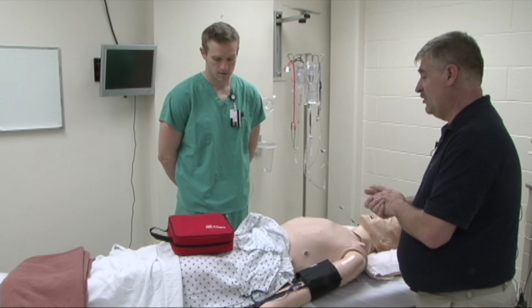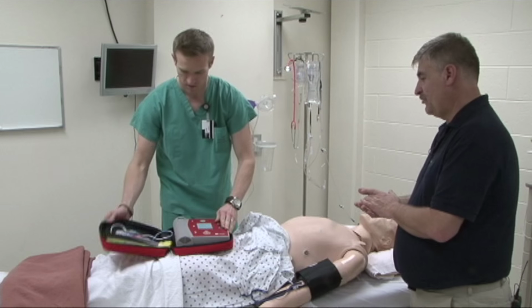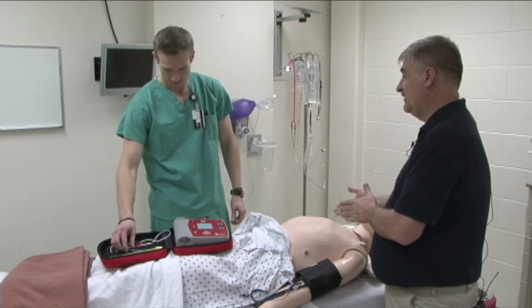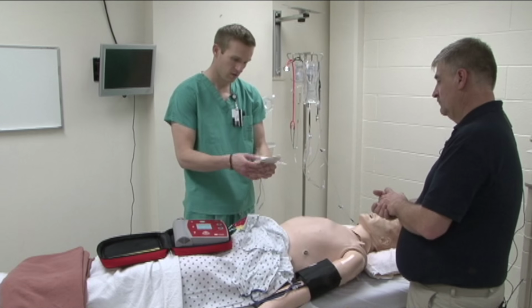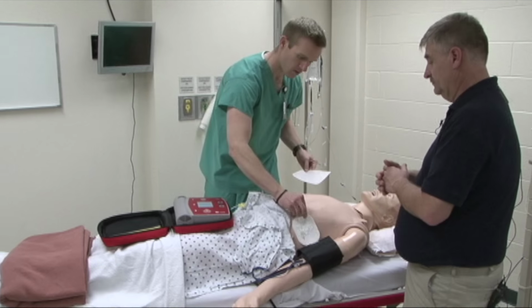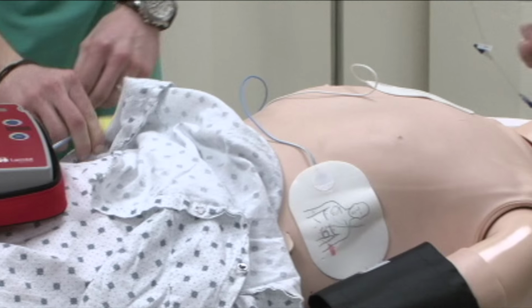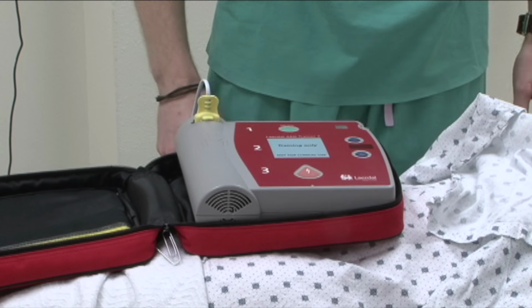Christian, what you're going to do is go ahead and open up the AED. Great. And now you're going to turn on the AED, which is on the button there. The second step is you're going to place the pads on the victim itself. There's a picture on the pad that tells you exactly where to place them. Like that? There you go. And now you're going to plug in the AED to the connector. And make sure that once you connect it, you stand clear.